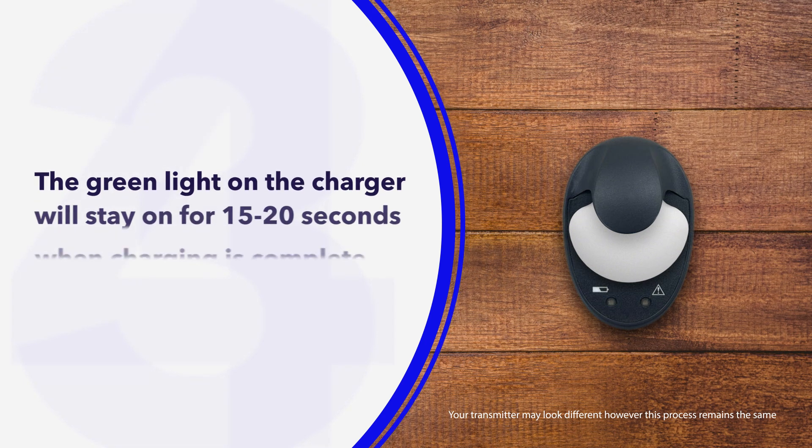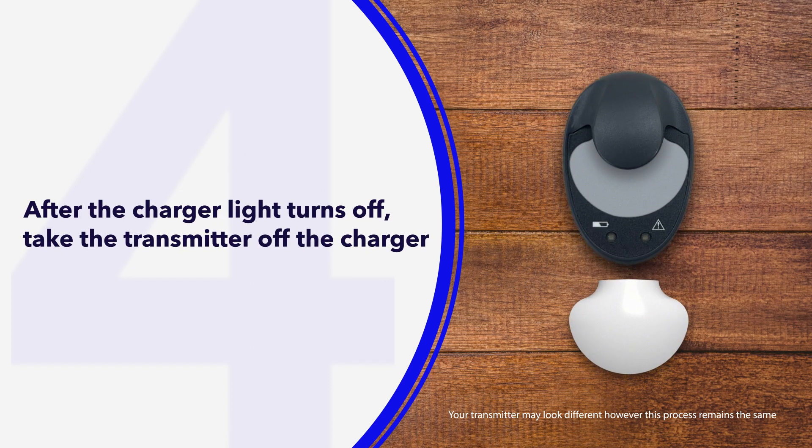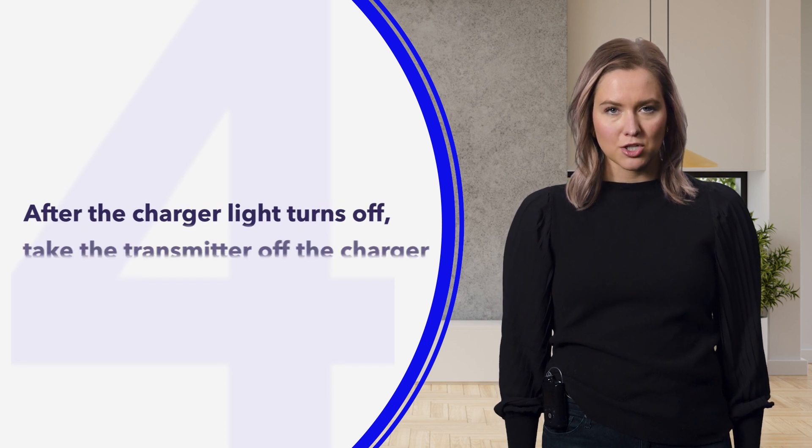Lastly, after the green charger light turns off, take the transmitter off the charger. The green light on the transmitter will flash several times and then turn off. If you don't see the green light flash on the transmitter, place it back on the charger until it is fully charged.